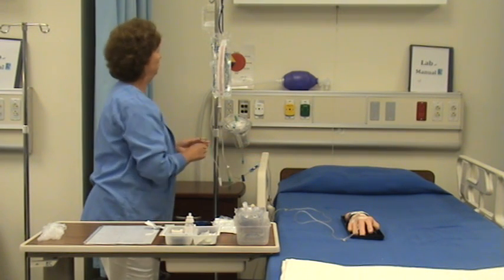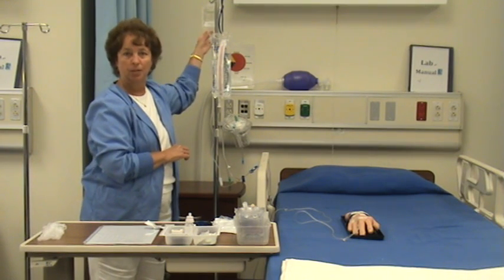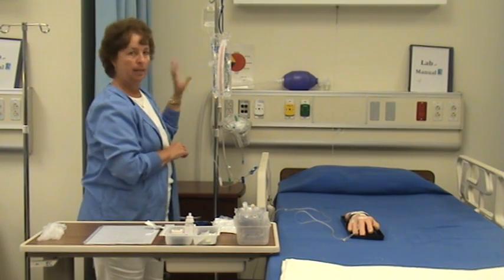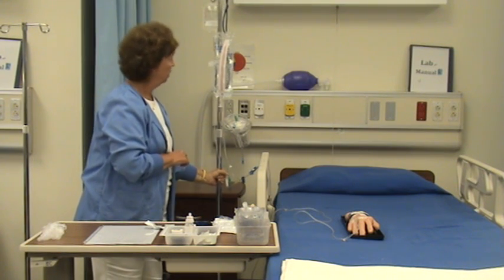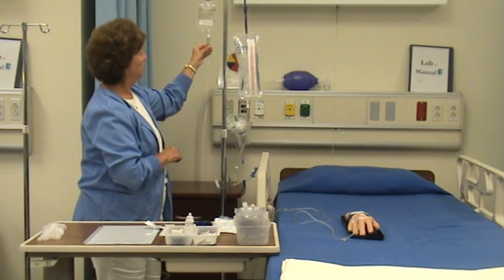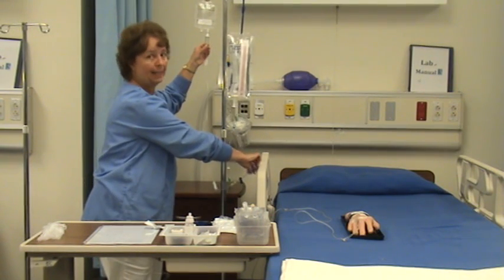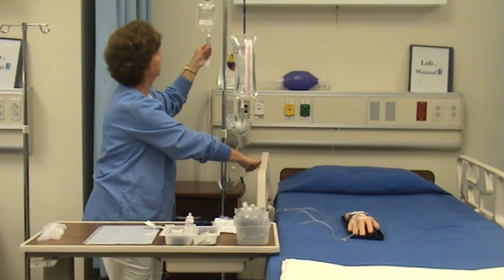Okay, and there's very little fluid, there's not 100 milliliters in here, so for demonstration purposes I left it like that, because what I want to show you is after this is done dropping and is empty, I'm going to speed it up a little bit. I want to show you what happens.